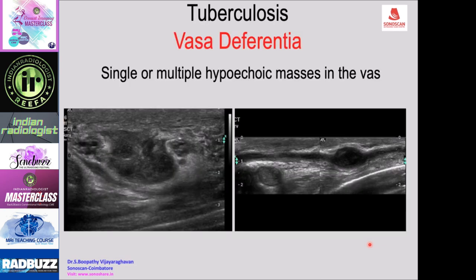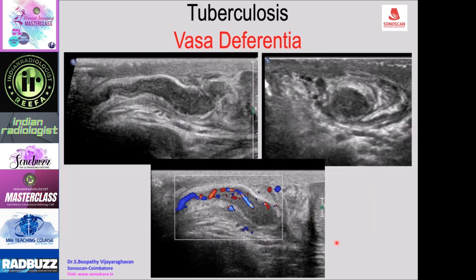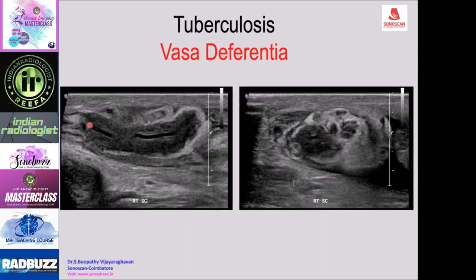Tuberculosis of the vas deferens can present as single or multiple hypoechoic masses in the vas. There may be an irregular mass in the spermatic cord just above the testis, with a thickened vas deferens and focal necrotic mass. Marked thickening of the vas deferens with focal increased thickening seen on longitudinal and short axis views, along with hyperemia on color Doppler, is characteristic.